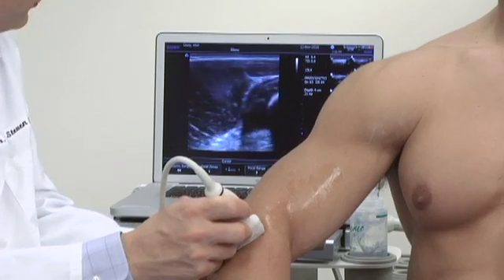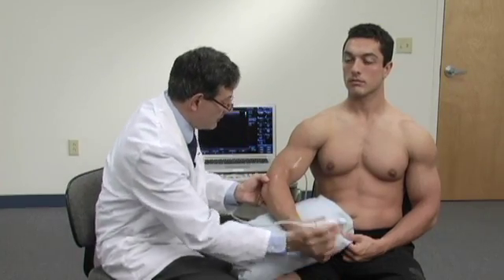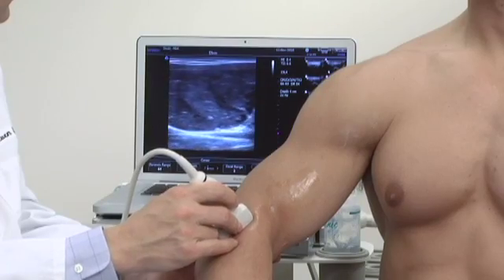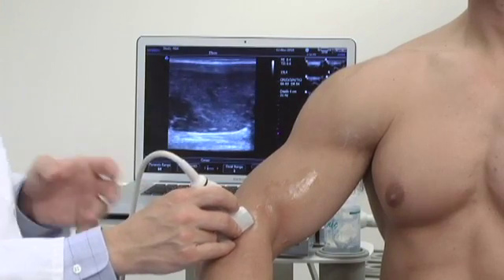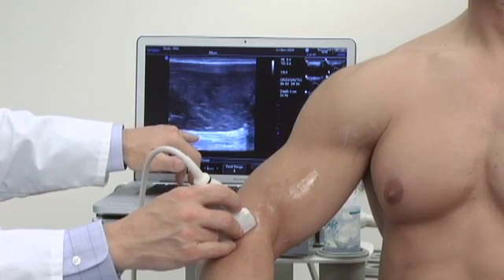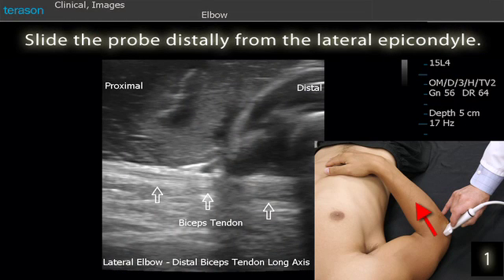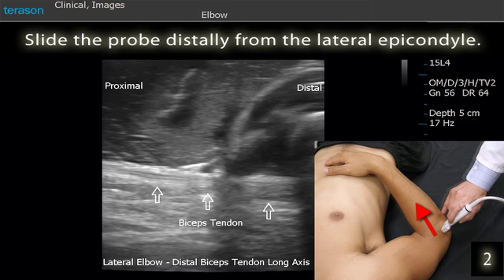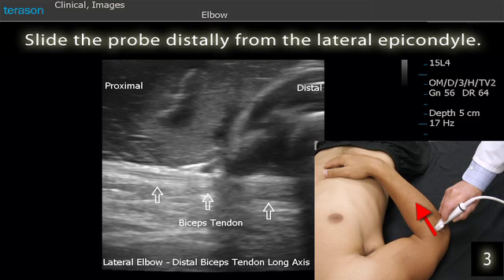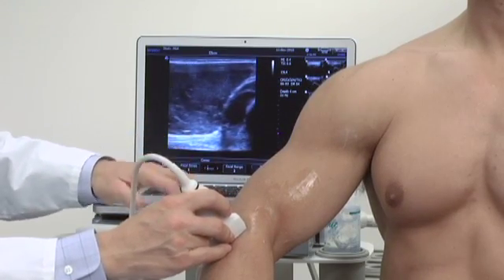We'll continue to move the probe forward. I'm going to position your arm slightly differently — I want your arm like this. And now at the very deep side of the picture, this is the biceps tendon. I'm going to come over a little further so we can see where it inserts, or where it comes into the radial head.